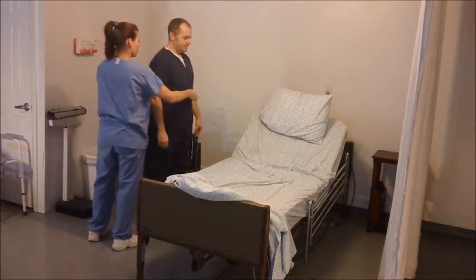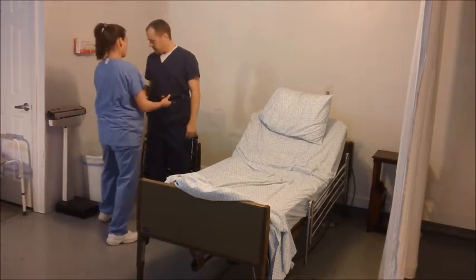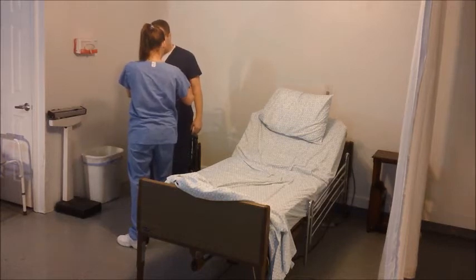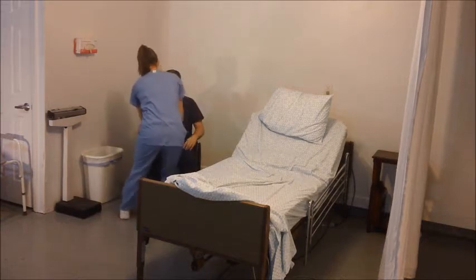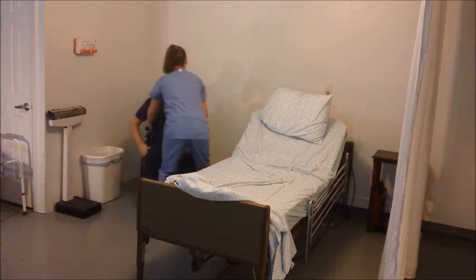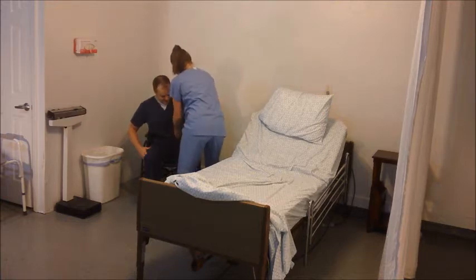Assist the client to turn and have back of legs positioned against seat of chair before sitting. Provide support to assist client to sit into chair. Remove transfer gait belt from client's waist without harming client when seated in chair after ambulation.